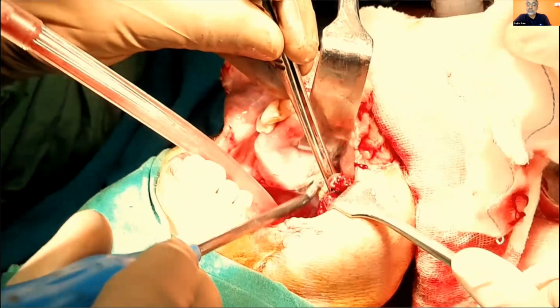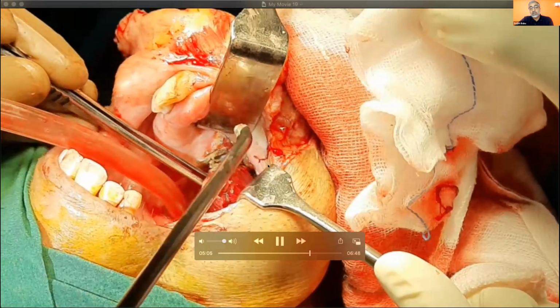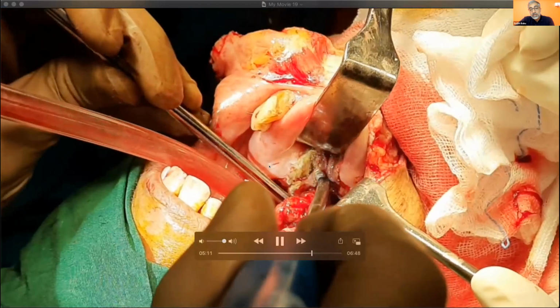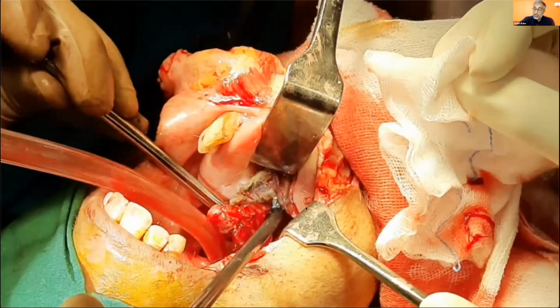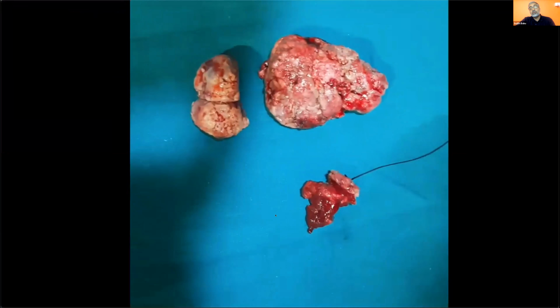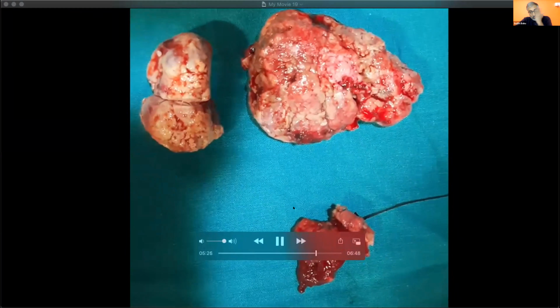and there is saline which is going on, and it washes away the chars and other things. So it's a very good cutting tool, wherein we can use it for the oropharynx, especially for base of tongue tumor. Because of the trismus, I had to do a lip split, which was already there for this patient, and we could achieve removal of this tumor. It was about an 8 by 8 centimeter tumor from the oropharynx.